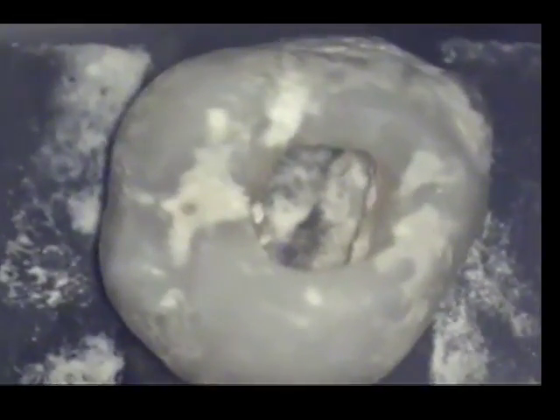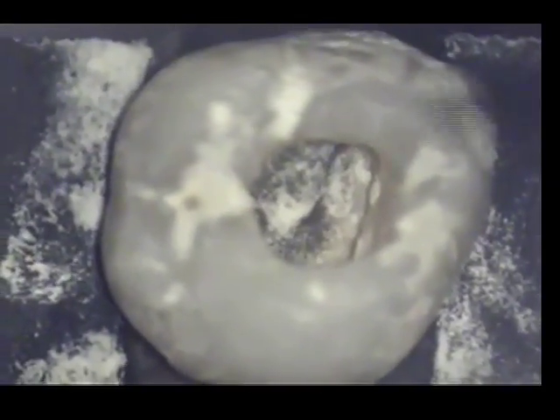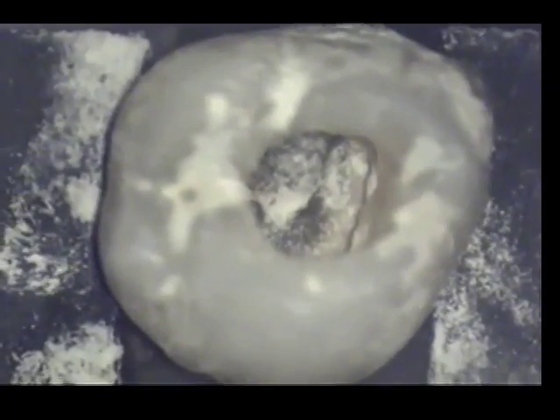At this stage, after extending the access laterally and lightly dusting the floor with the number 4 long shank high-speed round burr, the mesiobuccal canal with its lingual extension of tissue is clearly seen, as well as the orifice of the distobuccal canal. With a little more dusting of the floor, the orifices of the canals are visualized with increasing clarity. I work the mesiobuccal groove of tissue a little deeper to see if the mesiobuccal tissue will be one canal or branch off to 2 or more.